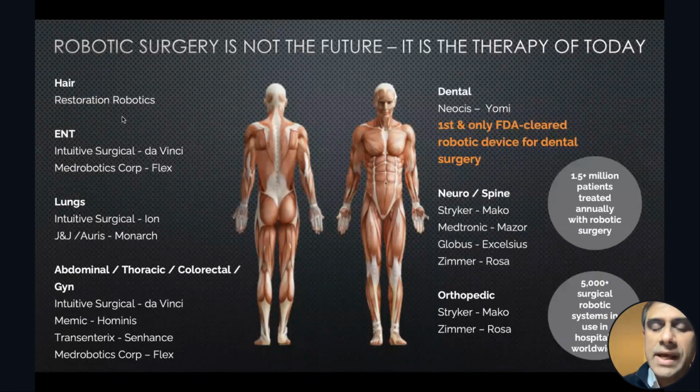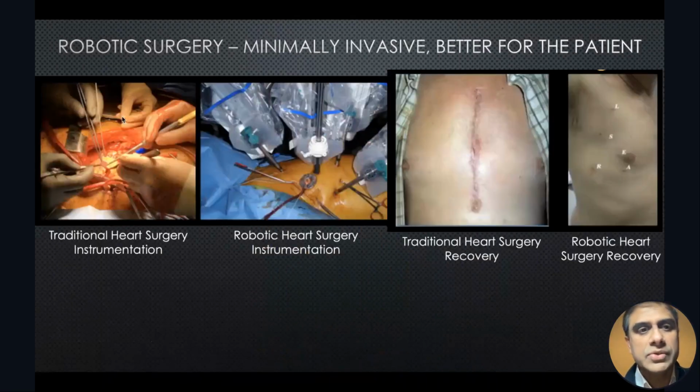That's the beauty of this whole dynamic navigation system, unlike a static guide, where once you planned it, you planned it. You cannot modify a static guide, and then you have to abandon the guide and go back to a traditional freehand implant placement. So huge advantages there. I'm going to start talking about all the clinical implications and how to use them.